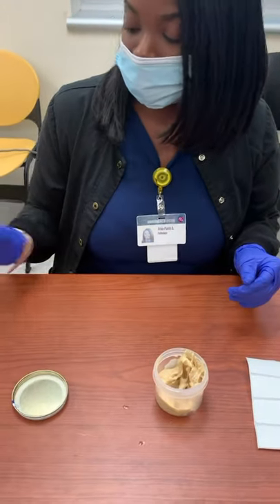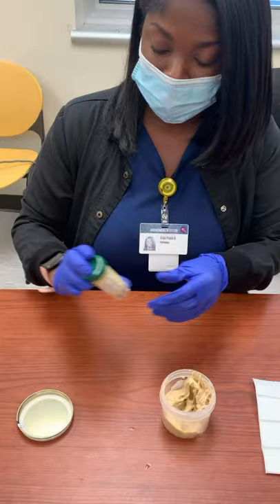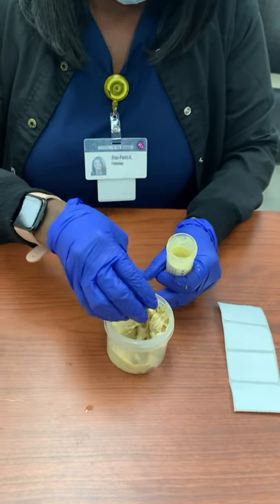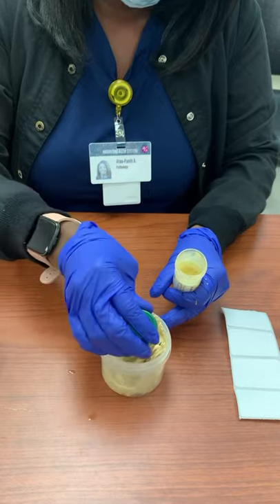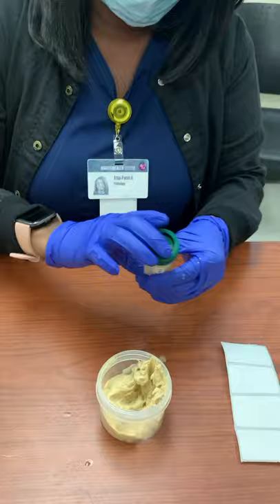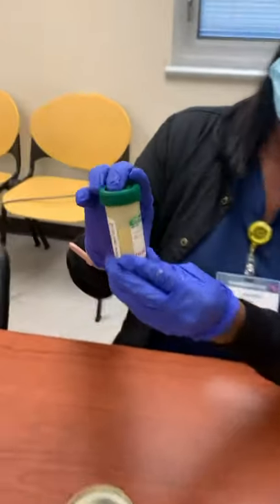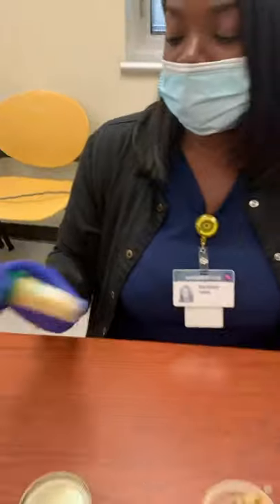Shake it again — almost there. This is about right here. Okay, so this is acceptable.